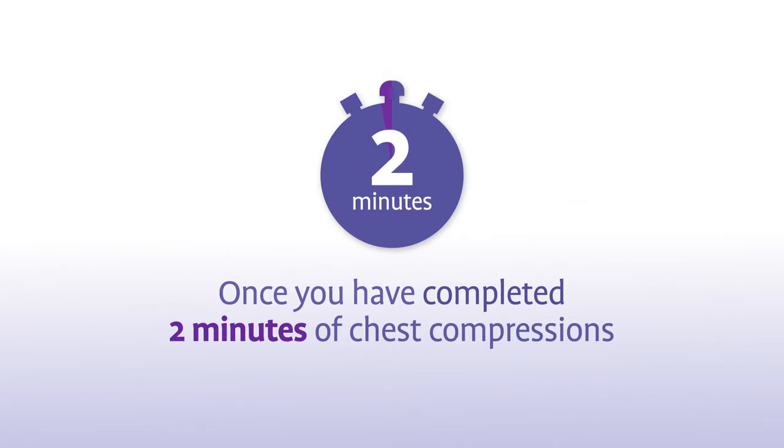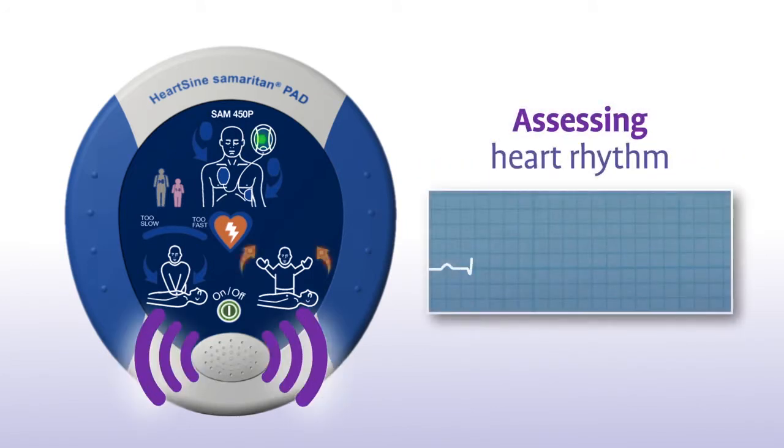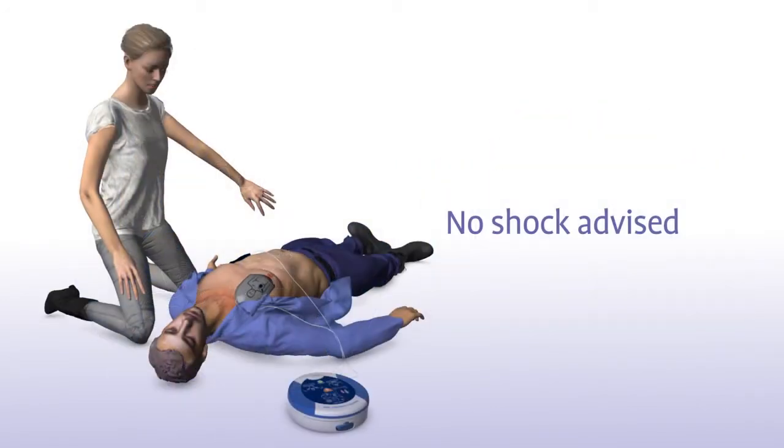Once you have completed 2 minutes of chest compressions, the SAM 450P will prompt you to stop chest compressions and again assess the patient's heart rhythm. Sometimes, no shock is needed in a life-saving situation. No shock advised. The Samaritan PAD will tell you in that instance or advise you to continue to perform CPR.